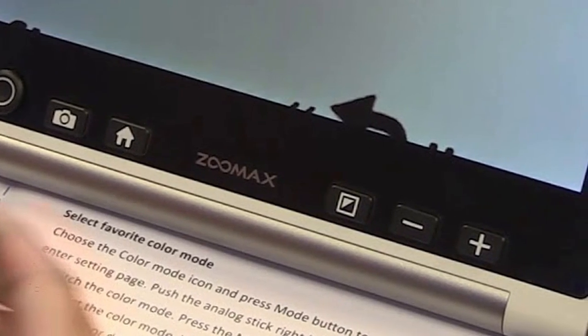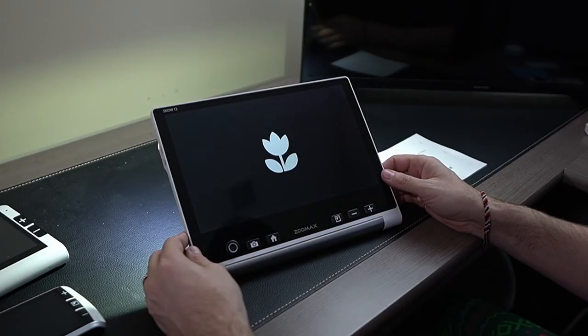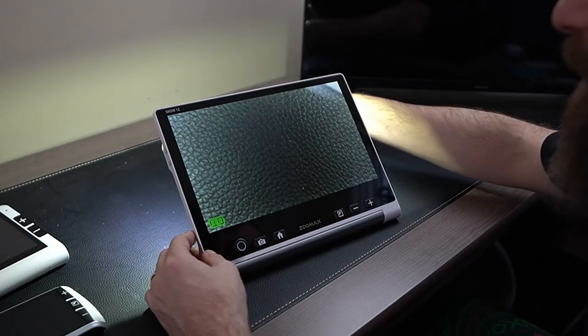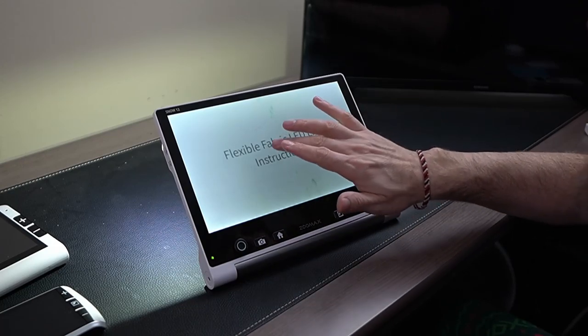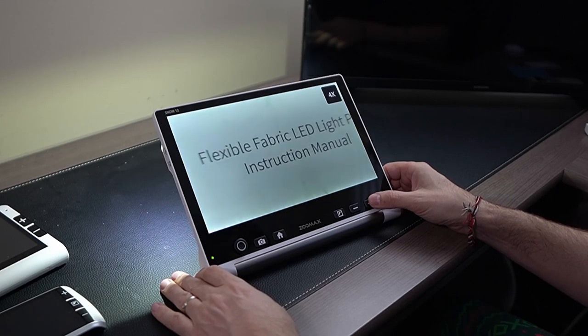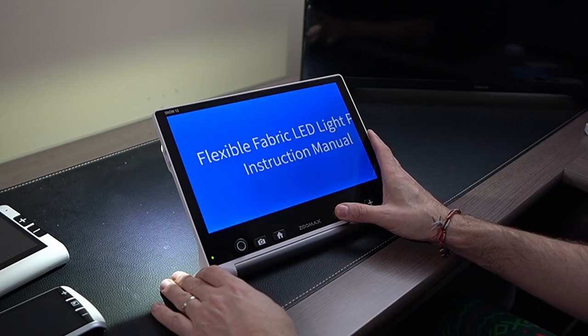Let's go ahead and turn on the Snow 12 digital magnifier. The light comes on and it shows that we are in magnification mode. If I put a document under here and tap to focus, we can use our buttons to zoom in and zoom out. We can change our colors — all the colors we're pretty familiar with.